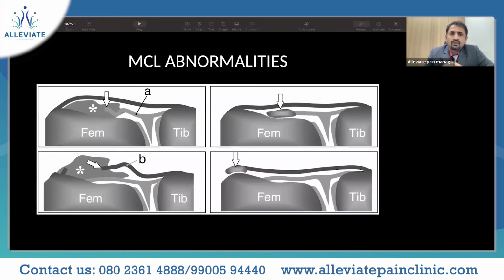Coming to medial collateral ligament abnormalities, as you all know, the medial collateral ligament has a deeper and a superficial layer. In A, you can see that the superficial component is intact, whereas in the deeper component, that's the meniscofemoral component, there is a detachment, and the asterisk points us towards a hematoma present at that area. In B, you can see that the deeper component is fine, but there is a hematoma and a tear of the proximal end of the superficial component of the MCL.